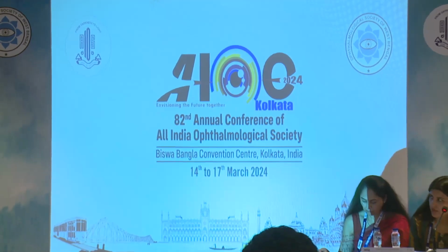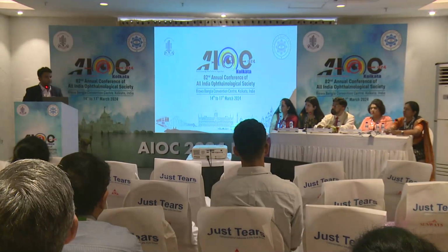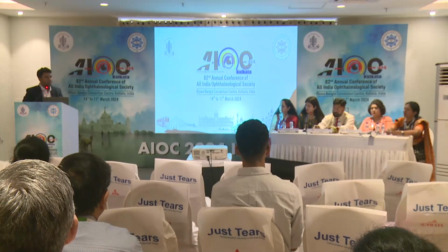Very innovative study, Dr. Akash. Could you tell me what the size of the CTR you used? 10, 12 or 11, 13? Yeah, the sizes were 11, 12 and 13. And in this particular study, it was a random choice.